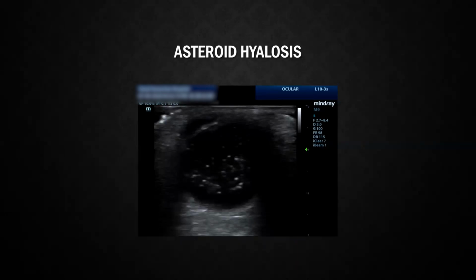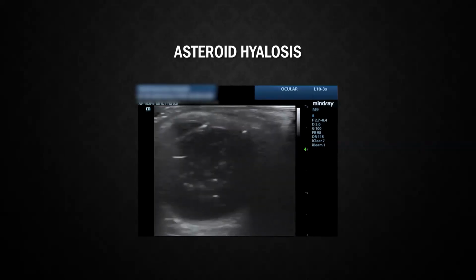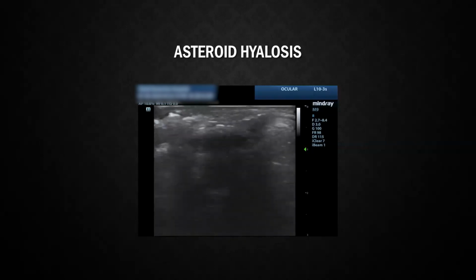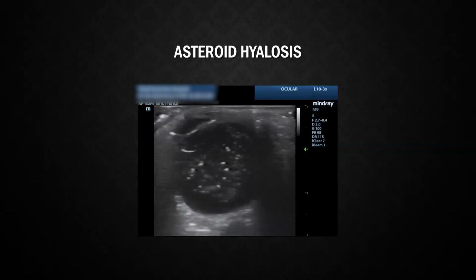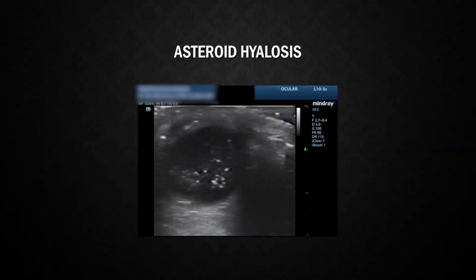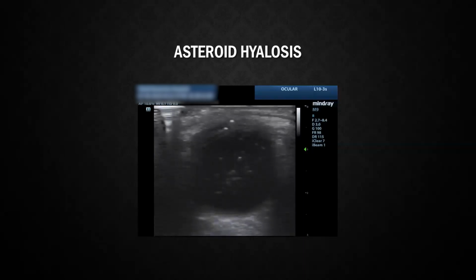And Stephen Elliott, who's on here, I think you did this because here's your initials. So this video, as you scan through, you see all of this contents in the back of the posterior chamber, and it looks kind of like a starry sky and a little bit scary, but it's just an incidental finding. And often, you know, this might be found in the opposite eye.